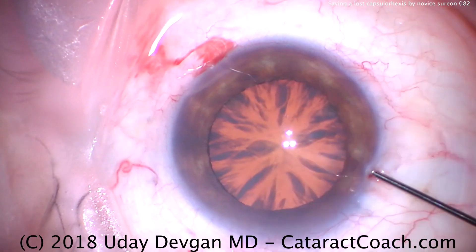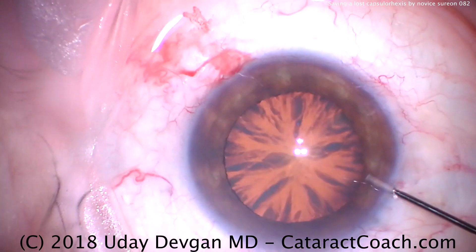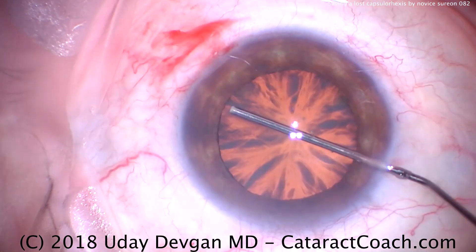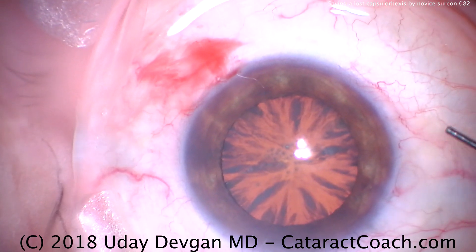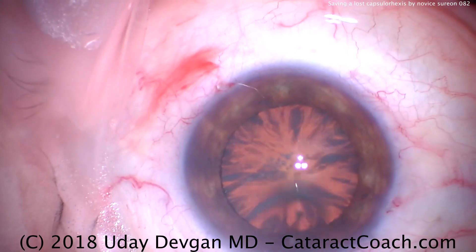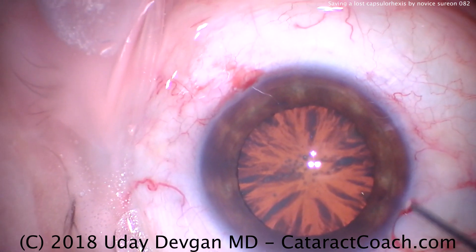You'll see my other videos on this site where I can do cataract surgery right-handed or left-handed — it just doesn't make a difference. I think a lot of expert surgeons, after many years of practice, are able to do just the same thing. There's the eye being infiltrated with anesthetic, and then the remainder of the anesthetic is being placed on the cornea to help numb the eye.